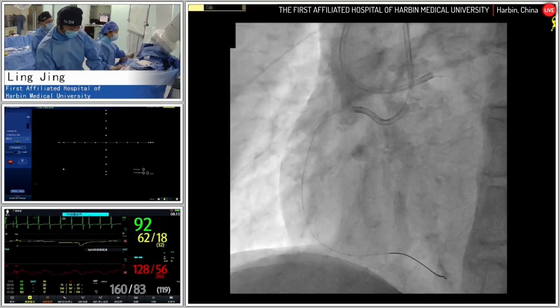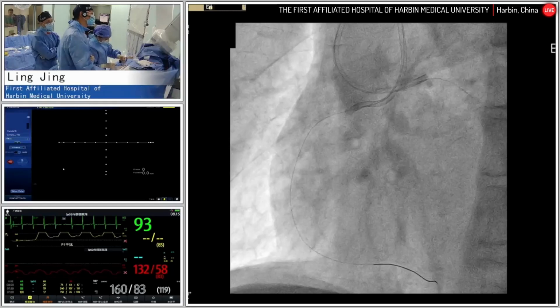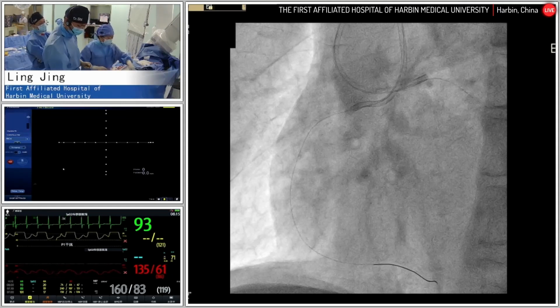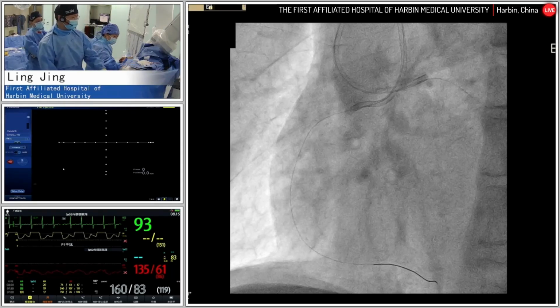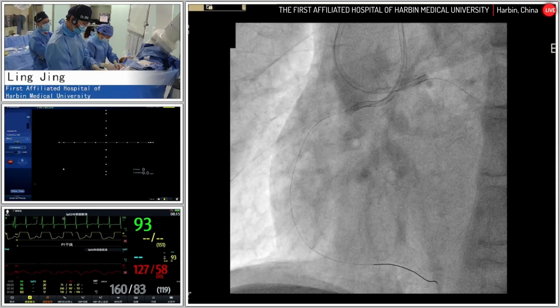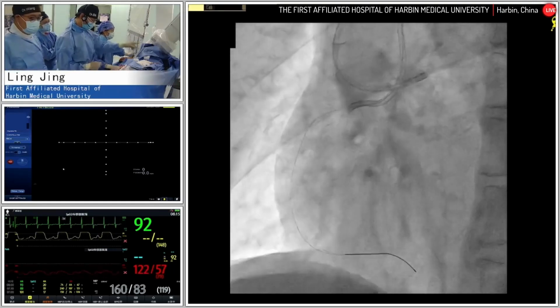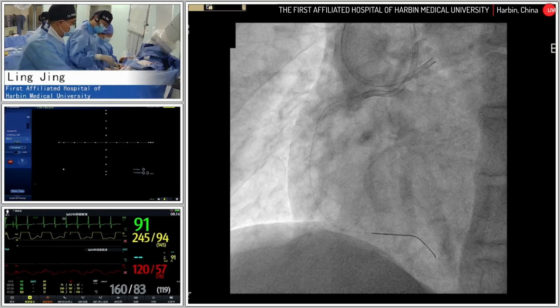So before we touched this patient, we had an IABP on standby because we noticed that her heart function is not that good. The IABP standby is of great importance for this patient because during the PCI procedure, the RCA guiding catheter is an AL1. After it engaged the RCA ostium, we noticed that it seemed to be deeply engaged, and the blood pressure on the RCA guiding catheter was a little bit damped because the ostium seems to have severe stenosis.